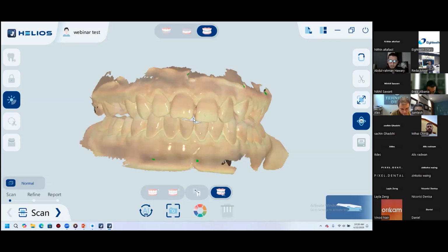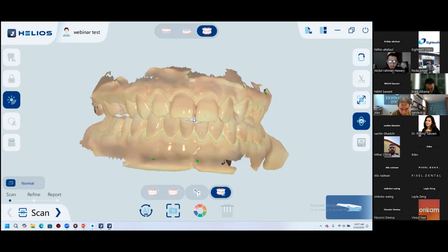Okay, sir. With standard usage, you will check that this will affect the workflow with higher accuracy. Dr. Remy from India. I have one issue.